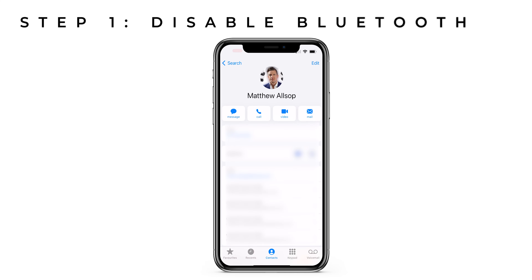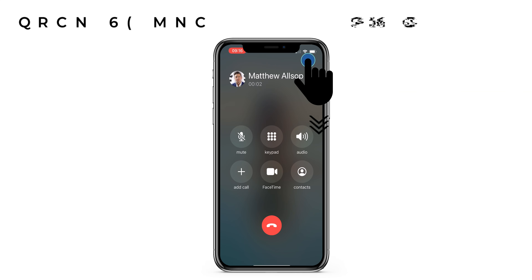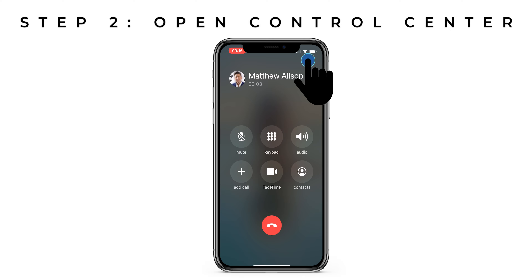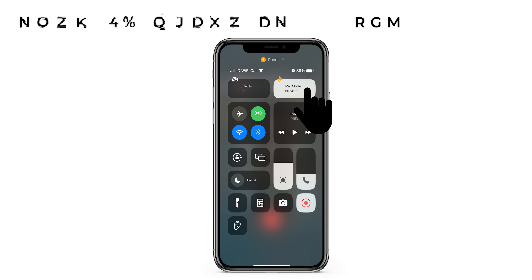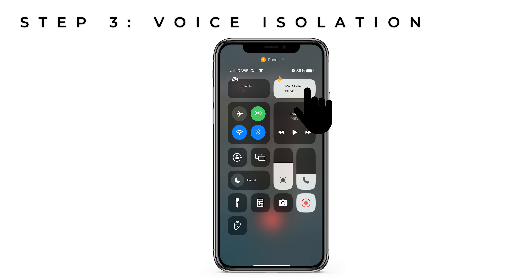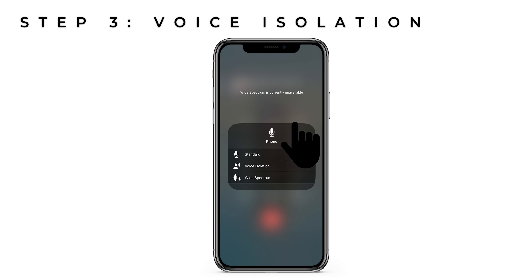As you need to be on a call to enable voice isolation, I would recommend dialing your own number or a family member's number and then moving on to step two. When you're on the call, take your finger to the very top right corner of your screen and swipe it down to reveal your control center. In the top right corner, you should see the mic mode bubble. Click on this and it will reveal three options: Standard, voice isolation, and wideband.